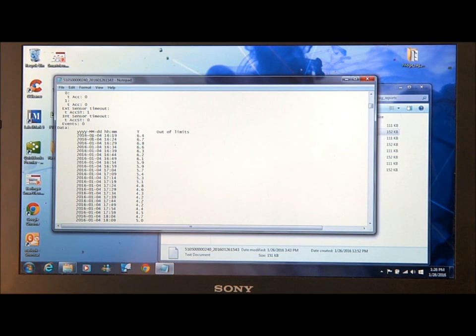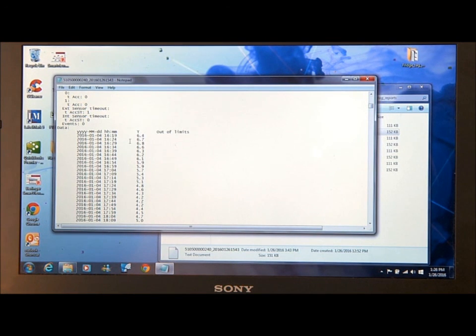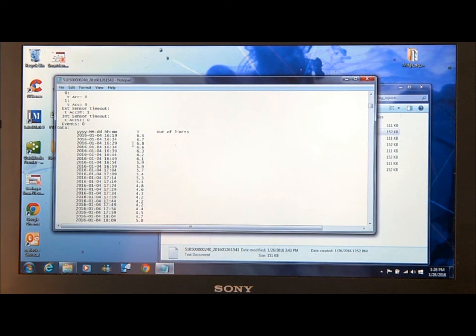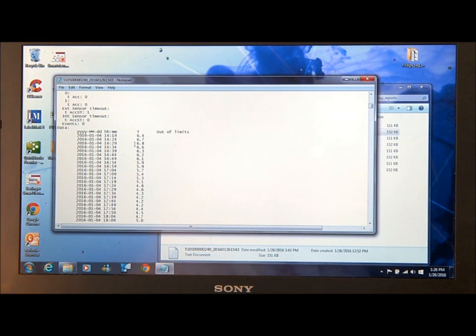We see year, month, day and time of the reading. It stores every 5 minutes for 56 days and you can see each temperature reading.